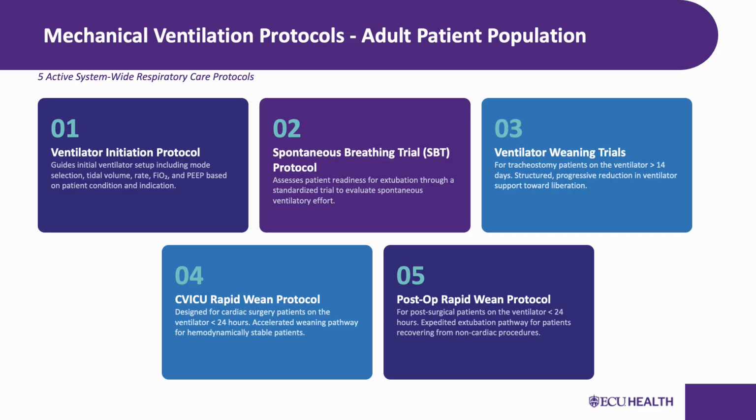Protocol 2 is the spontaneous breathing trial, or SBT, protocol. This is the B in our ABCDEF bundle, both SAT and SBT. This protocol is how we assess whether a patient is ready to come off the ventilator. We're going to be standardizing how we screen for readiness, how that trial is conducted, and what our pass and fail criteria look like. This is one of the biggest areas where consistent practice makes a measurable difference in reducing ventilator days.